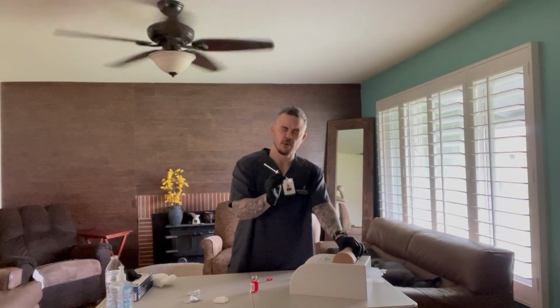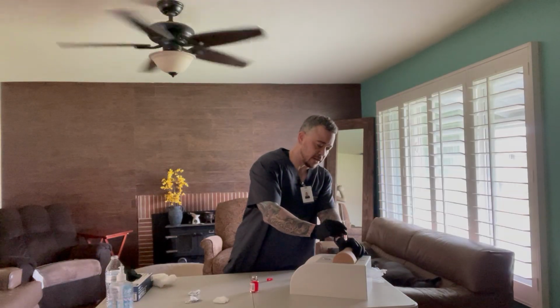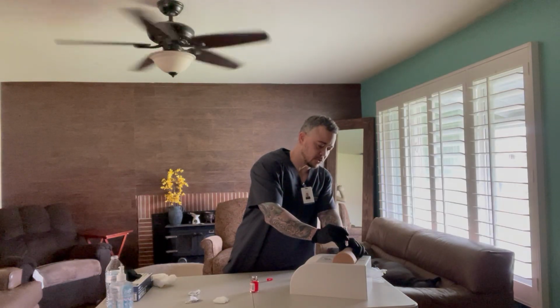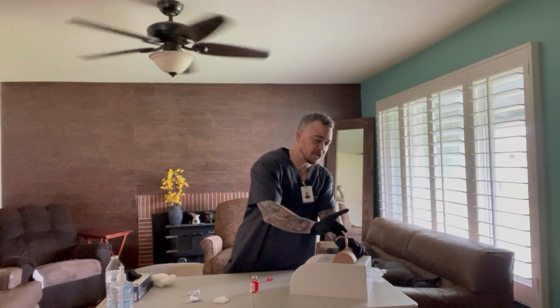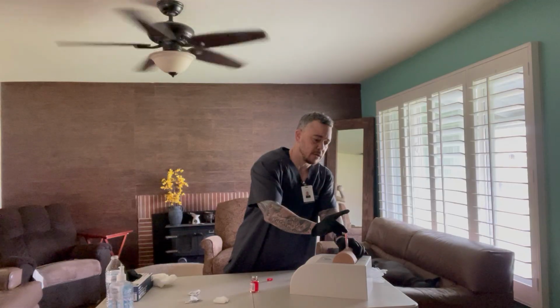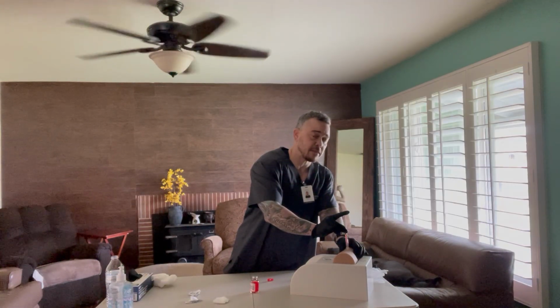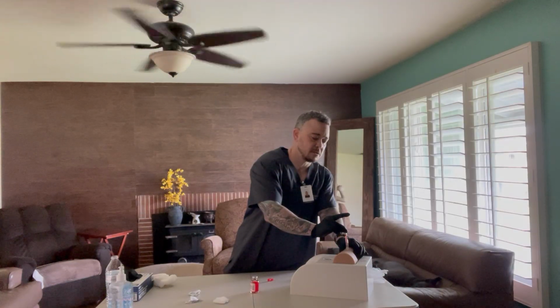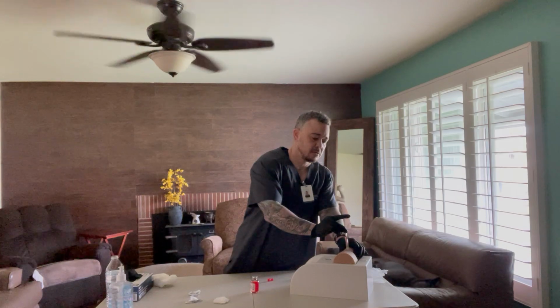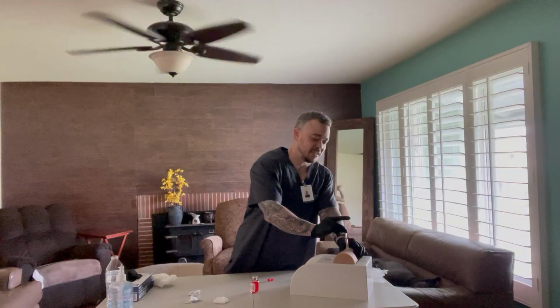And then I'm going to make sure I'm going from a 45 degree to a 90 degree angle, and inject the needle into the skin. While I push down the plunger, I'm going to insert the medication over 30 seconds. So I'm going to take 30 seconds to insert the medication. Okay. Insert it slowly for 30 seconds. That's how I want to say it.